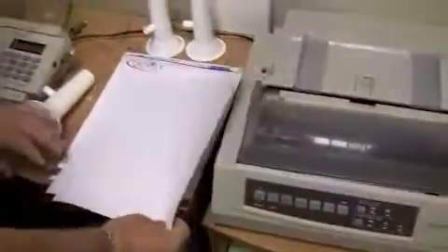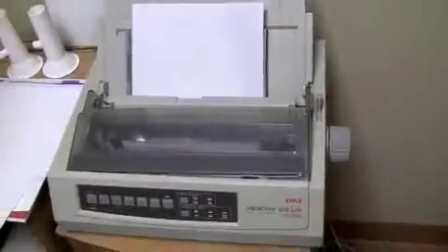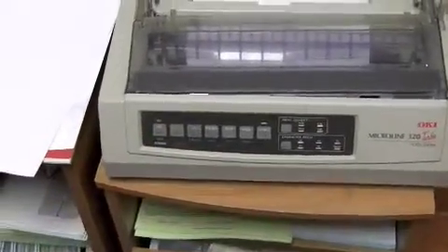At this point, what you want to do is take a piece of paper. We now have paper with our letterhead on it. You want to secure it into the printer, and you want to roll this up so it catches. Now, if the machine is going to do this, you still want to roll it up a little bit farther, to make sure that you get everything on there. As a rule of thumb, you want to make sure the paper is at least to the top ridge there, and then at that point you should be fine.